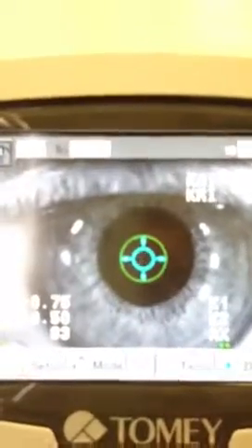So now we're going to go right back to refraction mode, so we'll change that back out. The cone should have gone back in. Our patient will put their head in the chin rest, and it should be fairly automatically aligned. You can literally grab the screen and move it to the patient's eye, push forward, until the machine automatically takes the readings. That was her left eye, so now we will hit the button for the right eye. The machine is moving, going straight over on its own, taking its readings.